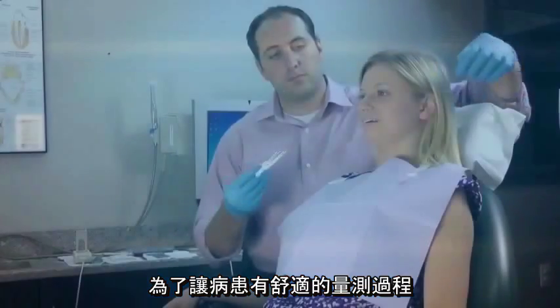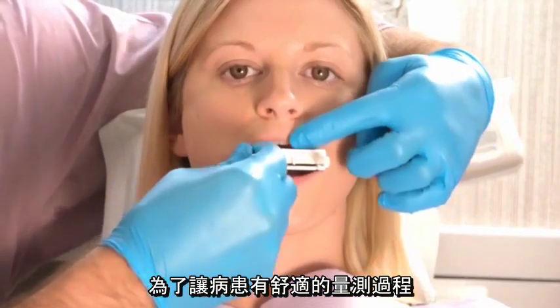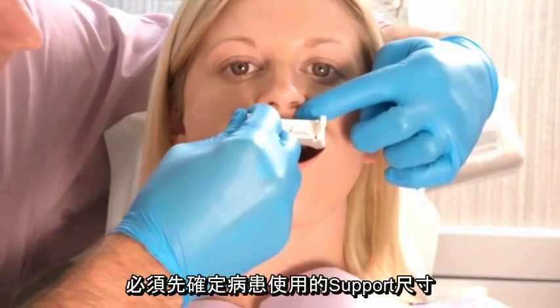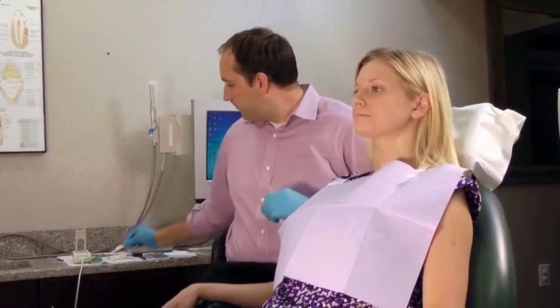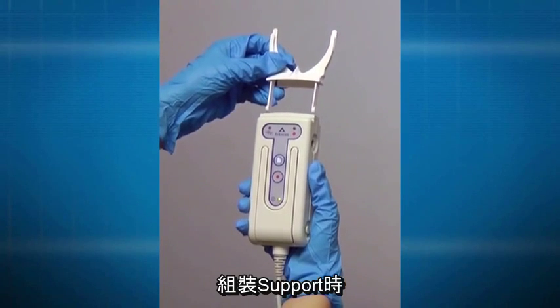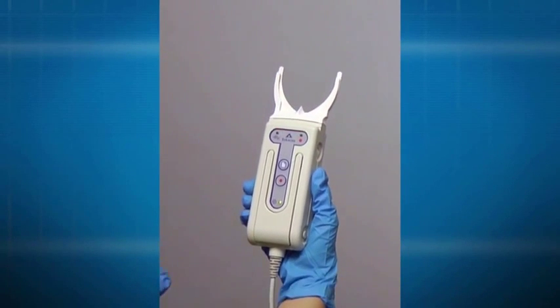The support should provide enough width to clear the molars and allow the patient to close comfortably. Trial and error may be necessary to determine the correct support size. Attach the support to the T-Scan handle with the sensor position guide face up until it clicks into place.